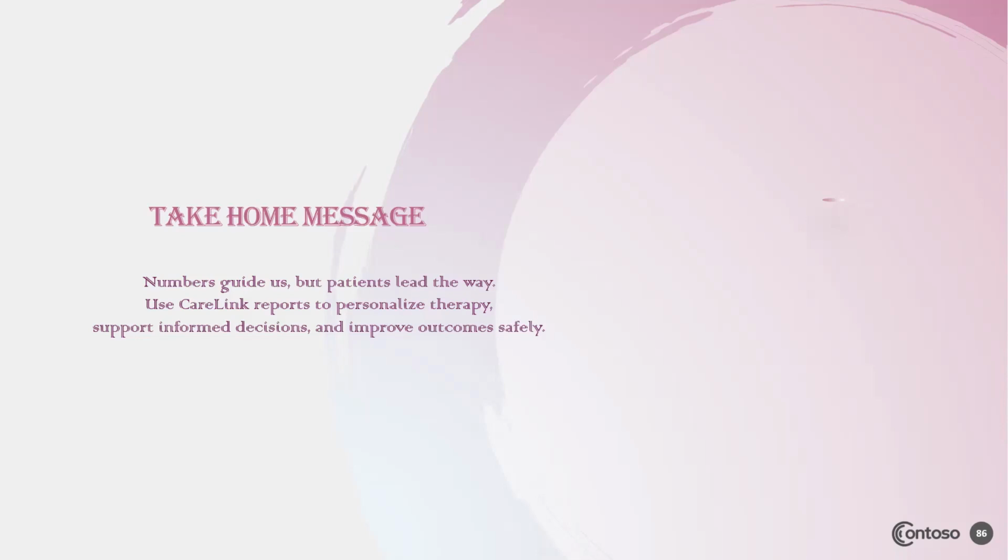Every time, remember that whenever we analyze things, we see the hypo issue, then we will see the hyper issue, and we will try to address the behavior and discuss it with the patient. So my take home message: numbers guide us, but patients lead the way. You need to discuss every detail with the patient, make sure he understands everything very well, and use CareLink reports to personalize the therapy, support informed decisions, and improve outcomes safely for your patients.